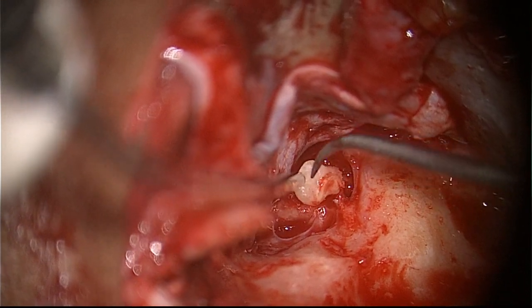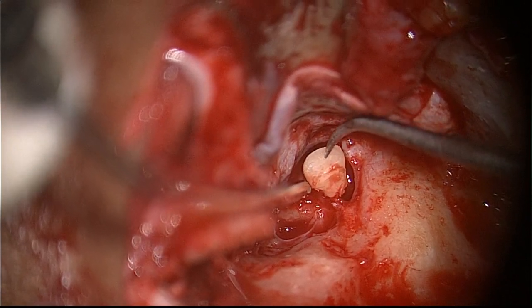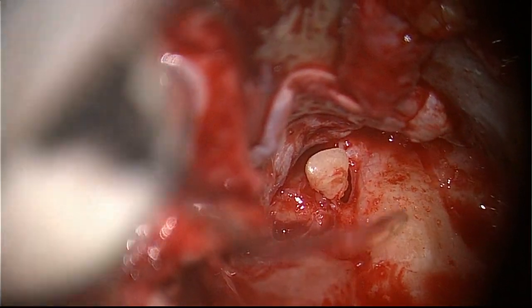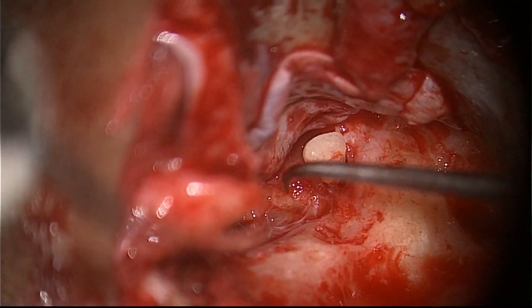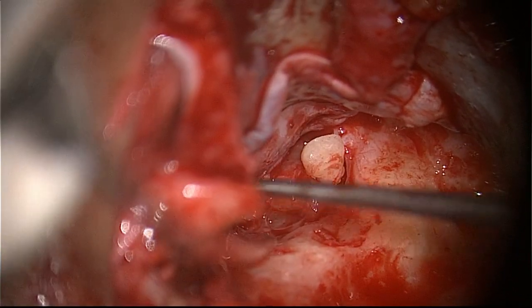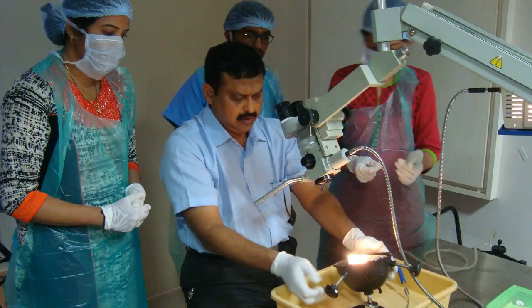In my hands, homografted or autografted septal spur cartilages or the ossicles are doing better. So I stopped using the alloplastic materials because they have got a high extrusion rate, and these autografted or homografted materials are giving excellent results in my hands.